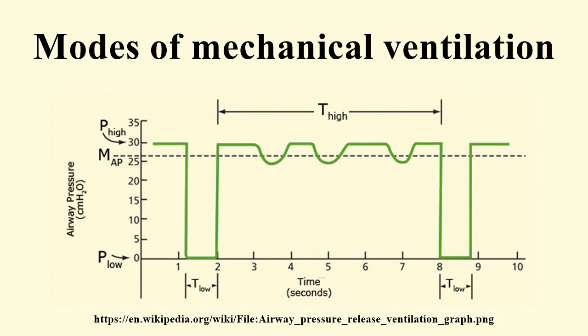A target is a predetermined goal of ventilator output. Examples of within-breath targets include inspiratory flow or pressure and rise time, tidal volume, and constant of proportionality between inspiratory pressure and patient effort. Examples of between-breath targets and targeting schemes include average tidal volume, percent-minute ventilation, and combined PCO2, volume, and frequency values describing zone of comfort.